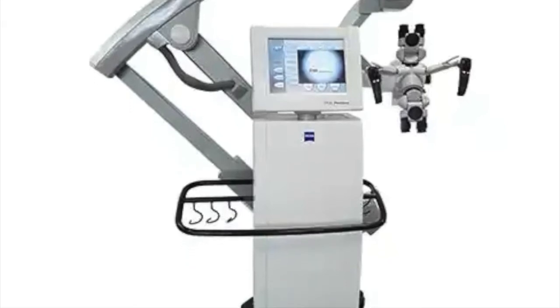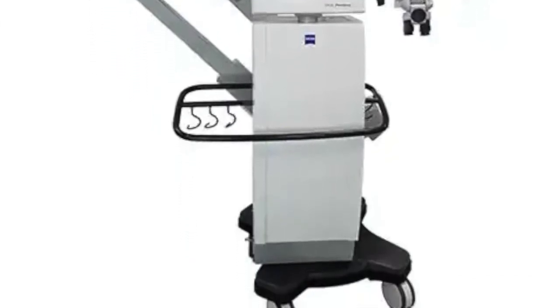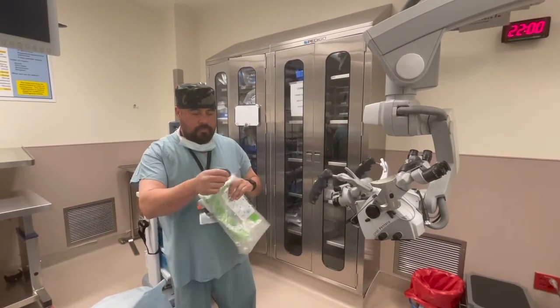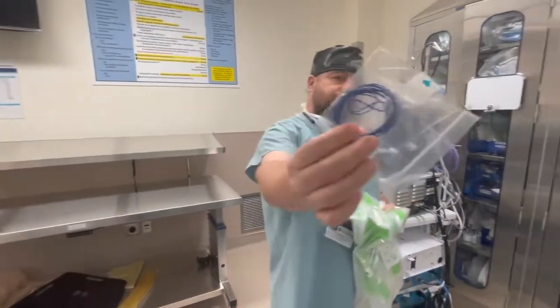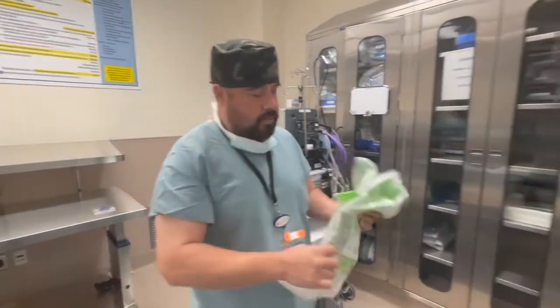I'm gonna show you guys how to drape a Zeiss microscope. Let's get to it. Okay, I got the drape right here with me. You grab the rubber bands that come with the drape. You put them on your back table. These are the rubber bands right here. I'll show you what to do with these rubber bands a little later. Let's go to the scope.